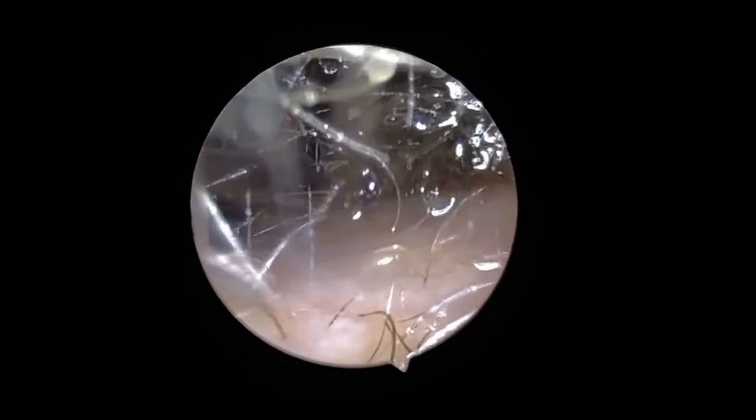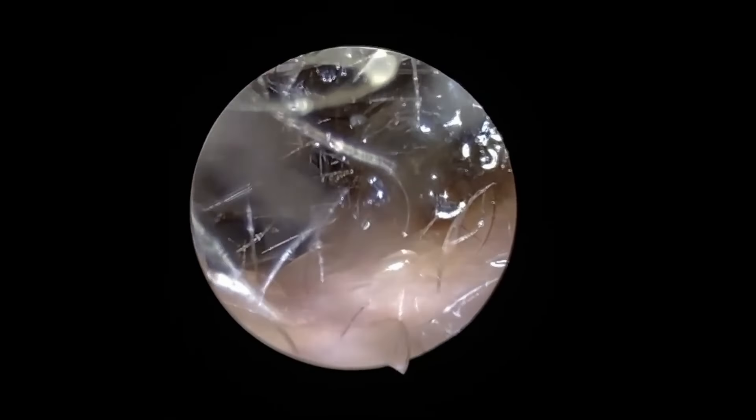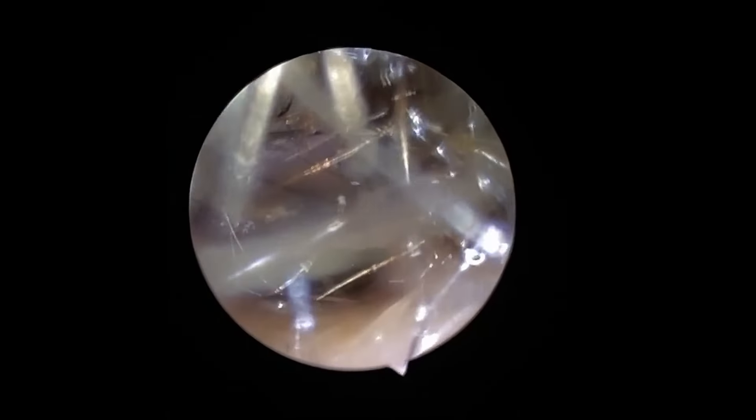As you can see, he has quite large tragus hairs in his ears, and when you go in to get beyond the wax to view the eardrum, the end of the endoscope tip gets smeared with oil, so at this point I can't view beyond the partial blockage.